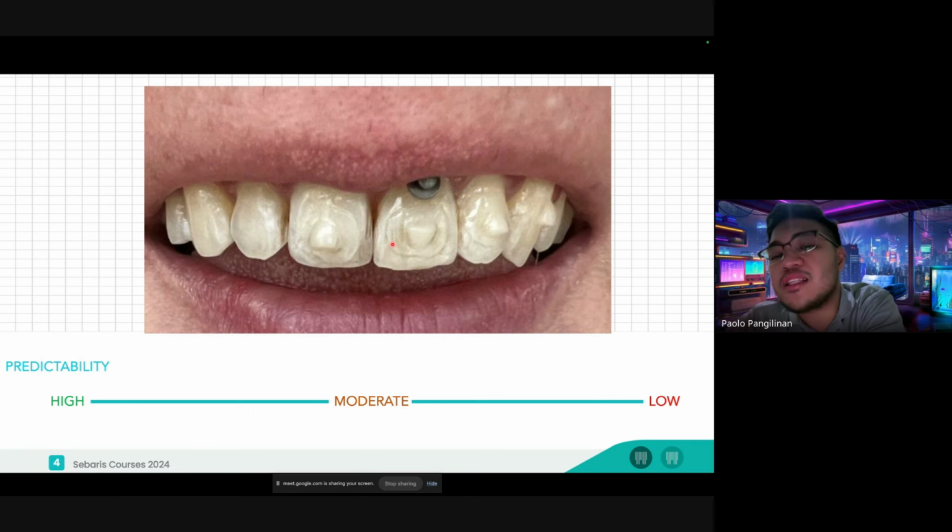So basically, we can somehow control the movements, okay? You have the power to do that. Now, auxiliaries will make your predictability a little bit better, okay? It's gonna improve your predictability. In some of our cases, it improved predictability tremendously. Once we considered the 5 basic principles together with our considerations on tissue reaction, it really does make a difference.